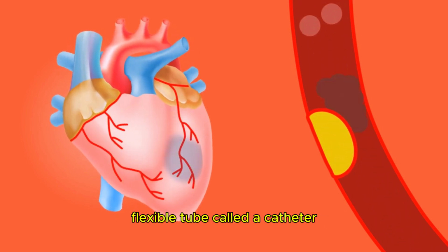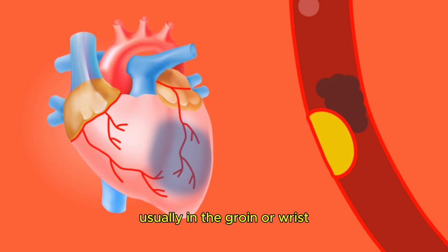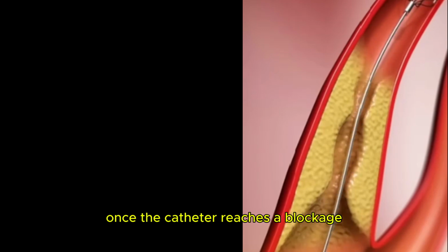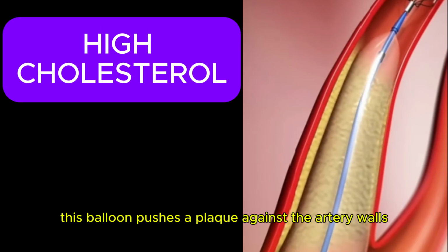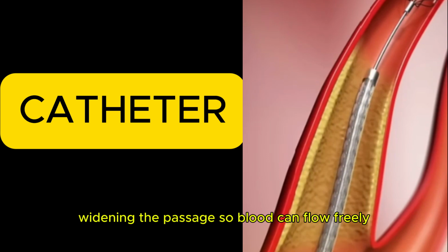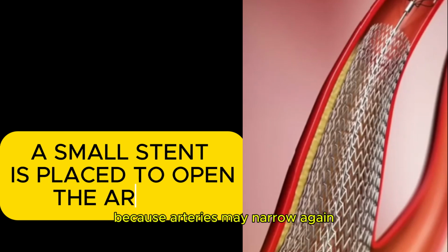A thin, flexible tube called a catheter is inserted through a blood vessel, usually in the groin or wrist, and guided toward the blocked artery. Once the catheter reaches a blockage, a small balloon at its tip inflates. This balloon pushes the plaque against the artery walls, widening the passage so blood can flow freely. However, this is only a temporary solution because arteries may narrow again.